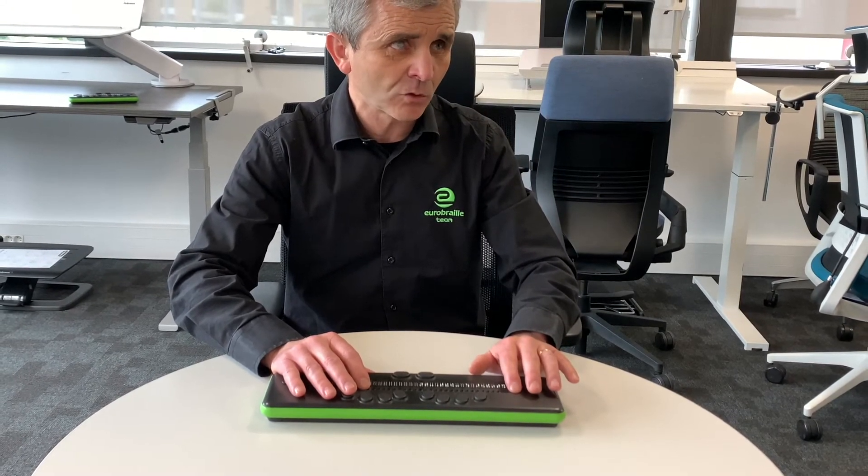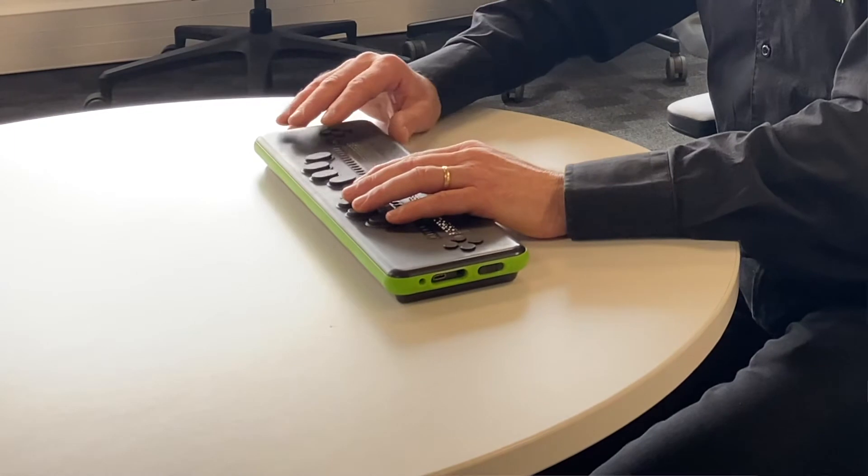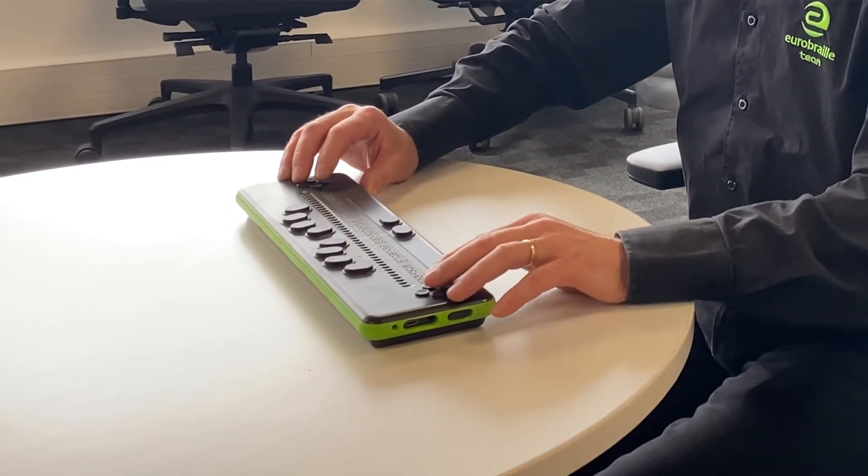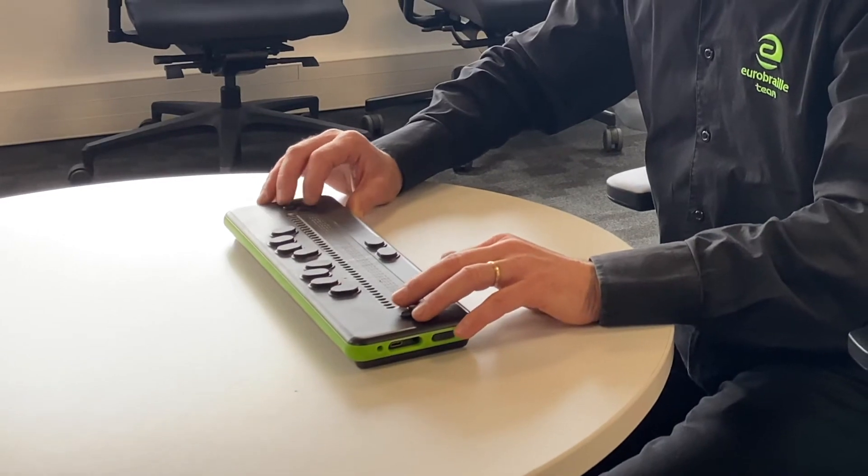A light click on the first routing cursor key moves the Braille display backward, whereas a light click on any other routing cursor key moves the Braille display forward. Of course, the buttons that enable moving forward or backward are still present, but this new double-click system will allow you to read faster and improve your efficiency.